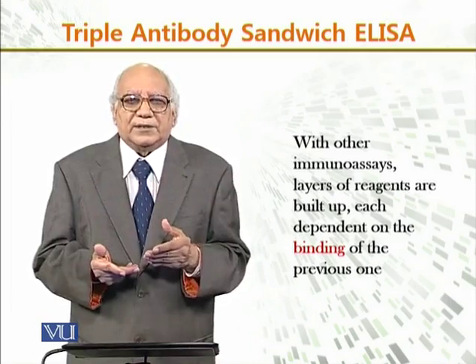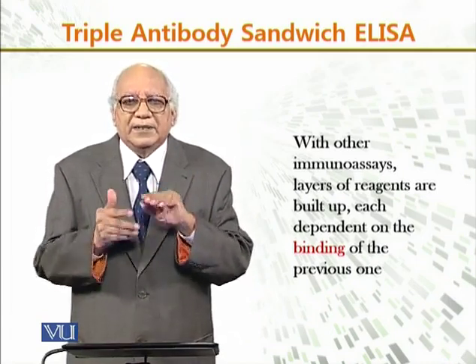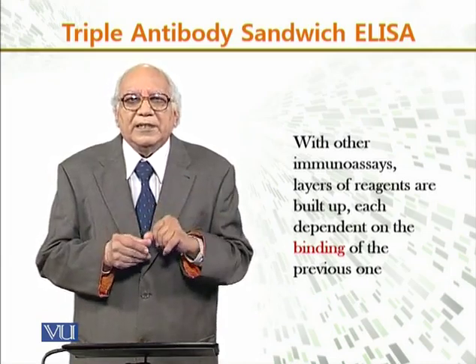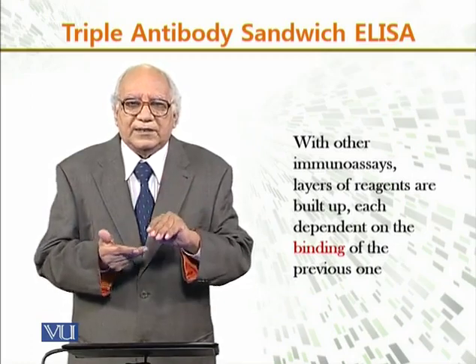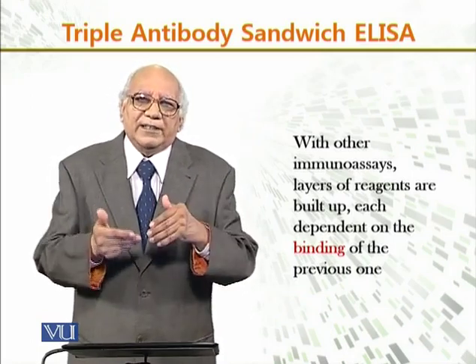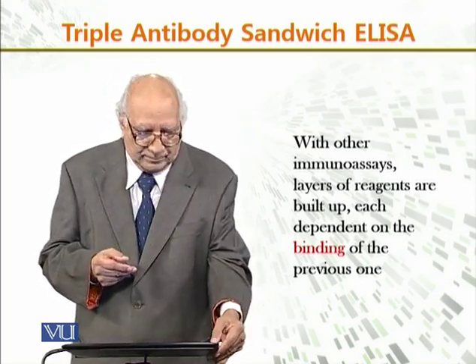With other immunoassays, layers of reagents are built up, each dependent on the binding of the previous one. When these layers are built up, they depend on whether the previous reagent is attached or not, just like photographic plates, when we develop them and use different reagents to check.